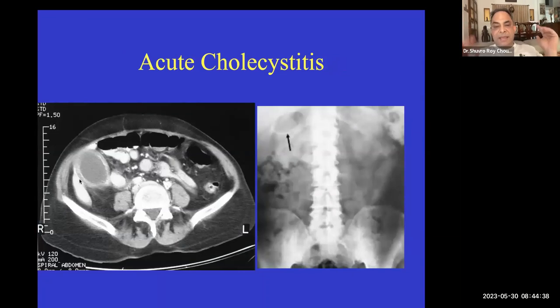Whereas a malignant thickening will be more enhancing, nodular, with irregular plane with the liver, and if you have a smooth layer of pericholecystic fluid, then that is more likely to be benign than malignant. Yeah. So those are the 4 things.